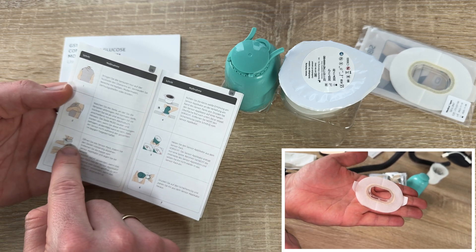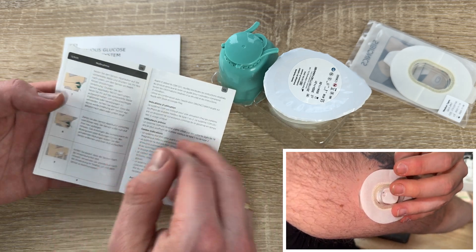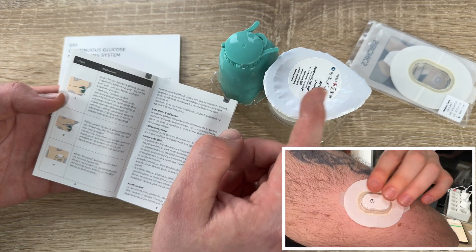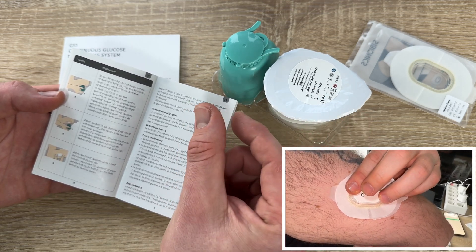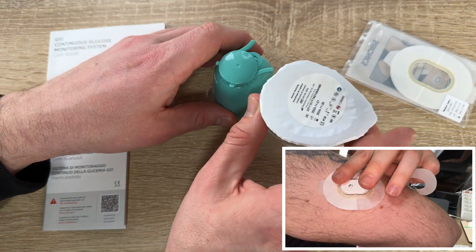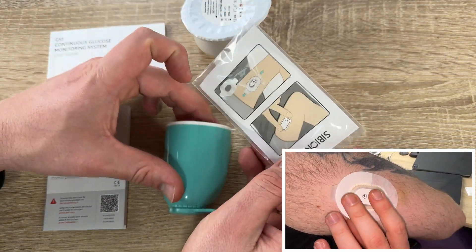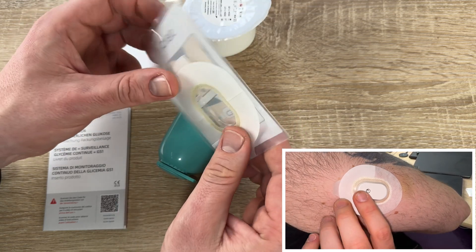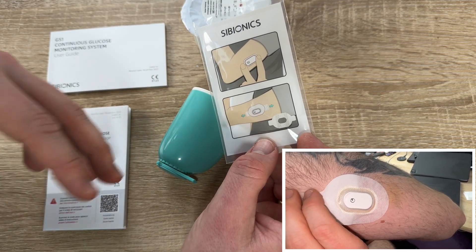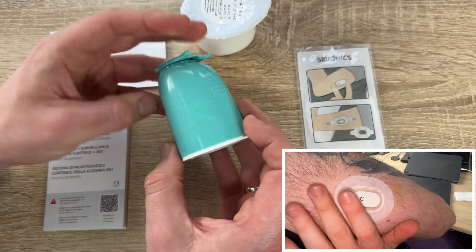Highly accurate sensor readings, 14-day continuous glucose monitoring, no calibration, no scanning, and exportable AGP reports. Real-time glucose levels shown directly, factory calibrated, and it is the lightest on the market at only 3.84 grams. The Cybionics GS1 communicates via Bluetooth with your phone. AGP reports let you record your lifestyle every day, with customizable alerts, instant data sharing, and IPX8 waterproof protection.